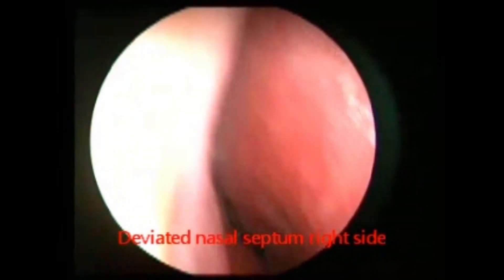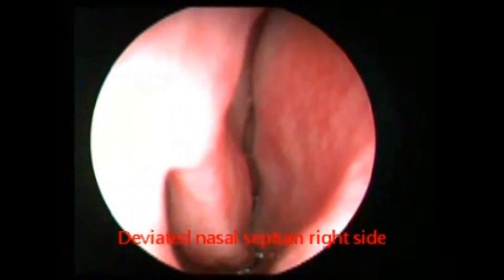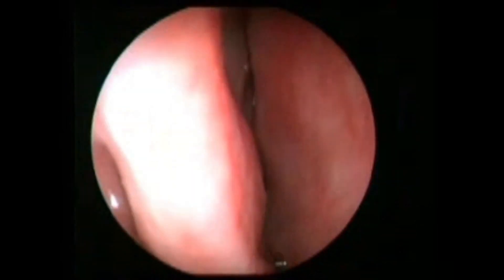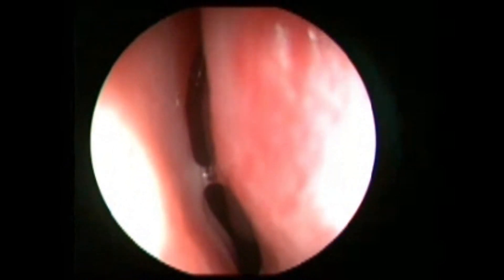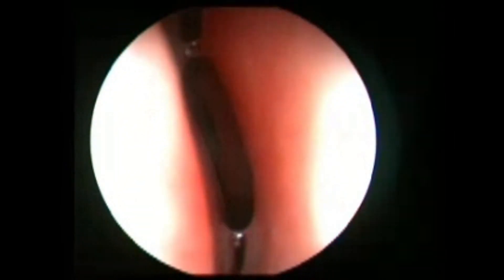You can see the inferior turbinate in the picture on the first pass, and as you can see, the second and third passes are not possible in this patient on the right side of the nasal cavity because of the marked septal deviation.